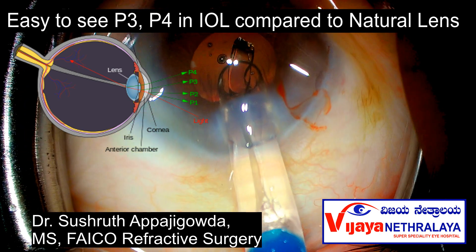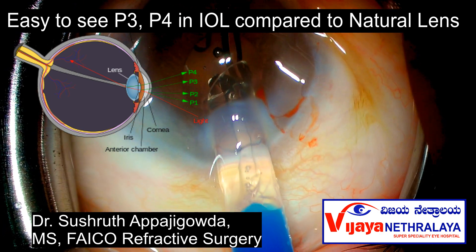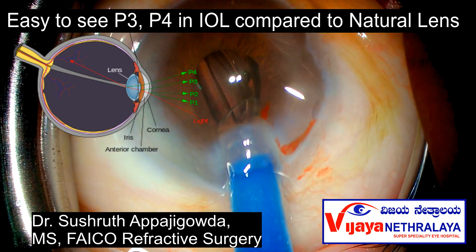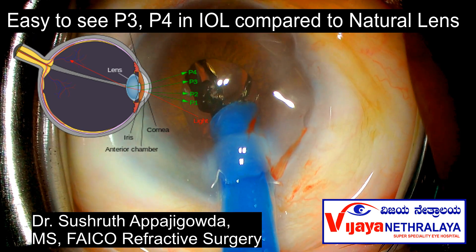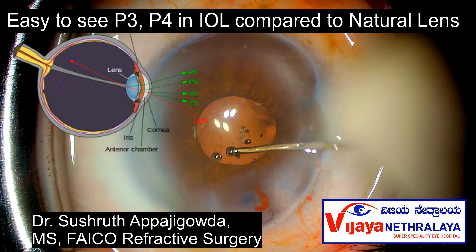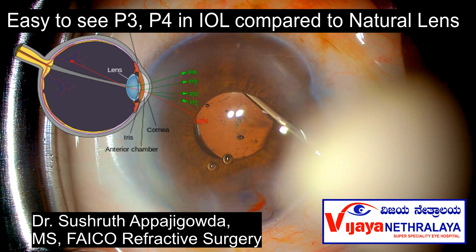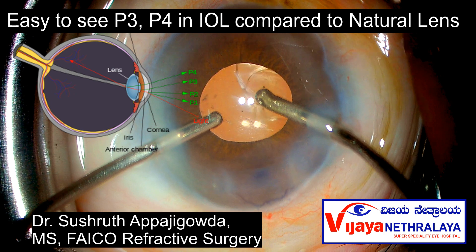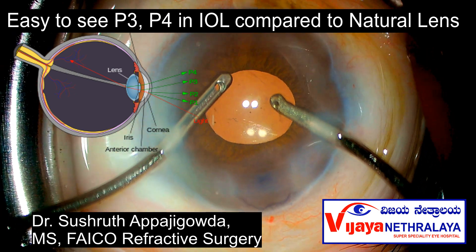Before the insertion of the IOL, we can easily see P1 and P2, which are very close to each other. P3 and P4 identification becomes easy after inserting the IOL. The inverted image of P1 is seen as P4, while a very large, enlarged image of P1 is seen moving very fast — this is P3. P3 is the largest of the reflexes.